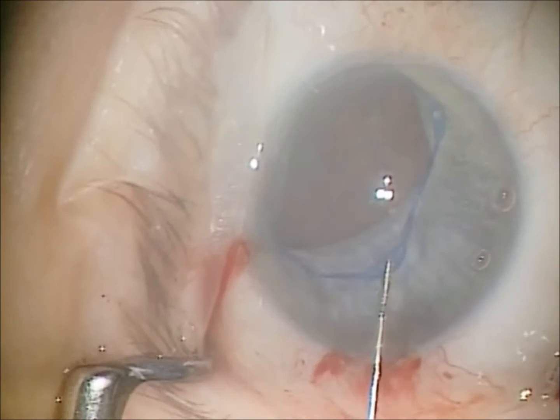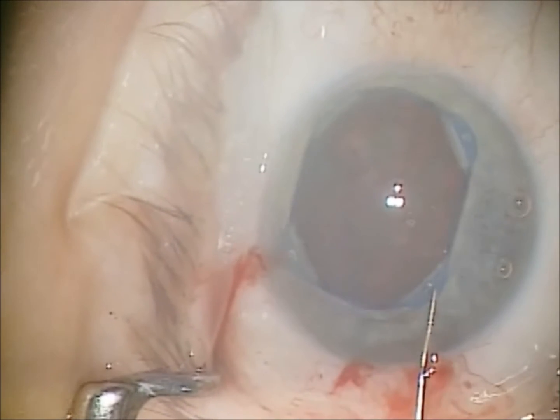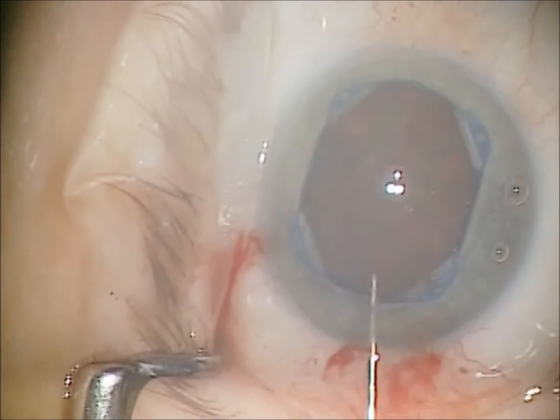Here we're engaging the last corner, and once all corners have been engaged, you can actually physically just move the whole dilator apparatus to the center and then you're ready for surgery.